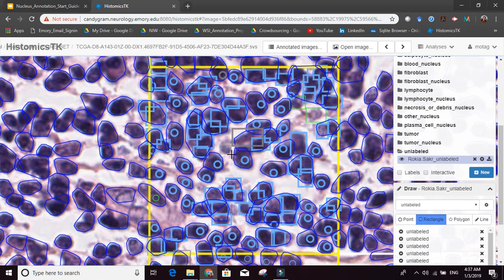I think it's objectively vague. This one is vague. This one is vague. It's not clear what this is. See this one in the background? This one is vague. It's hard to assign this a label. So there you go. That's the full field of view with every single nucleus annotated. Now the nice thing about correcting computer annotations is that a lot of these things we just placed a dot.